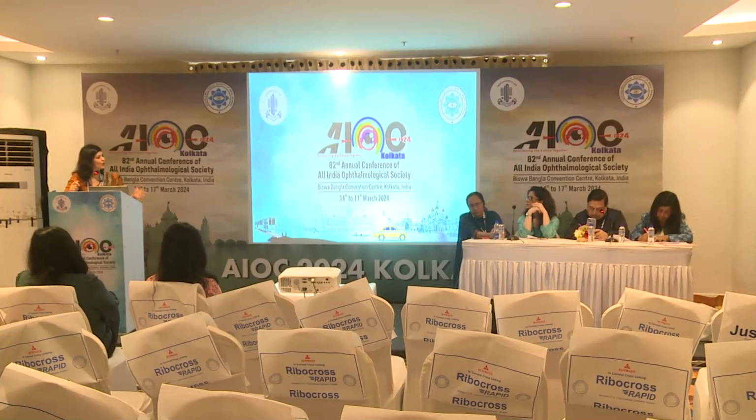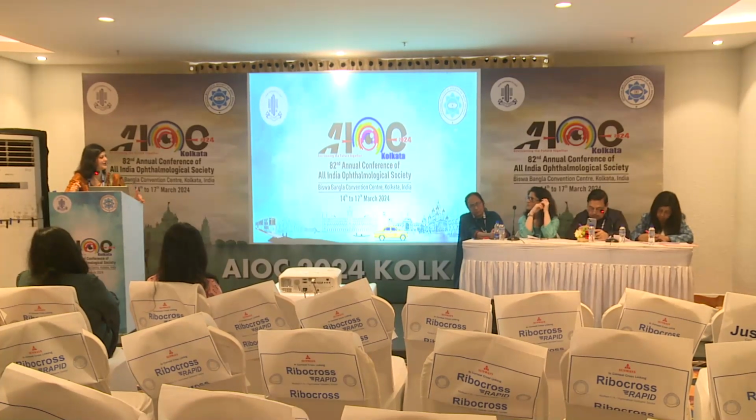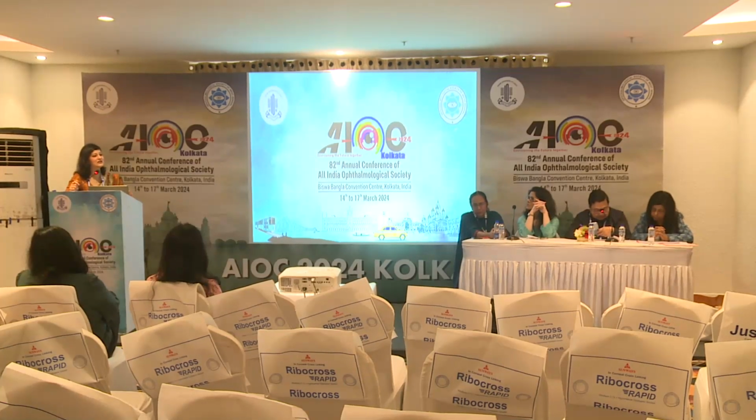The purpose of the study here was basically to assess the complication rate, because what is discussed about INTAX is that it has a very high complication rate. But if we look at 54 patients being operated, 3 had an explant, so overall the complication rate was not so high. Here it appeared as 12% being high because we had only 24 patients for whom the long-term data was actually available. So the purpose was not to see how much it is improving, but how much damage it is doing to the eye.